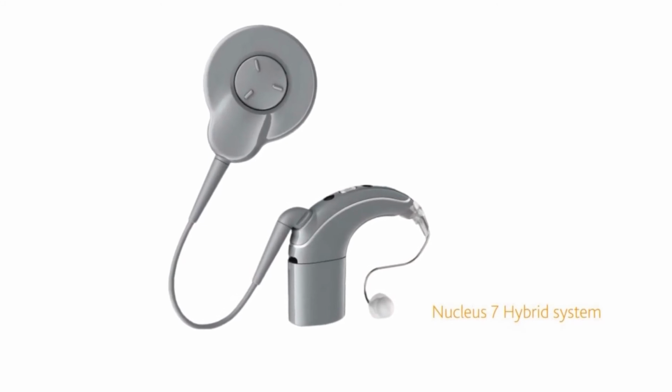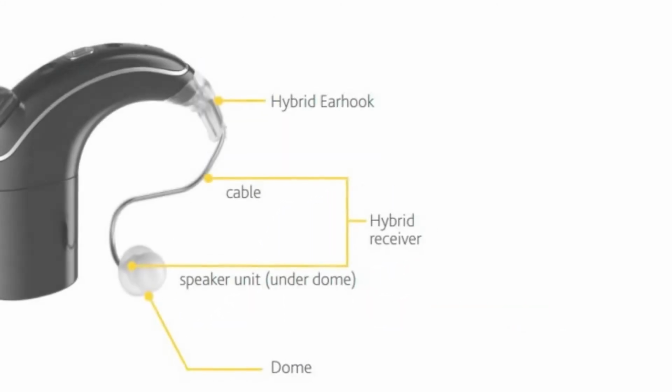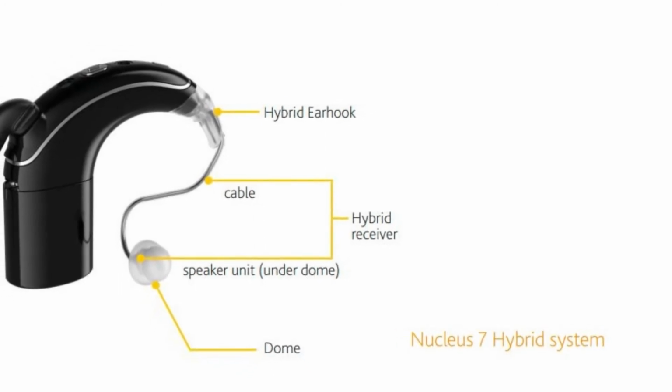Now, we've had some success with frequency lowering, and I know that's been a popular adjunct to what acoustic hearing aids have been able to do. But we're finding that combining and matching that acoustic signal in the low frequencies, allowing for good perception of the fine details of the low frequencies, where you can actually appreciate music better, and then using the electrical part of the stimulation in that high band pass to help with speech understanding, these patients do quite well, and they get the double effect.